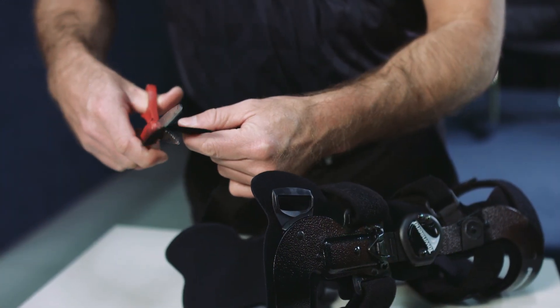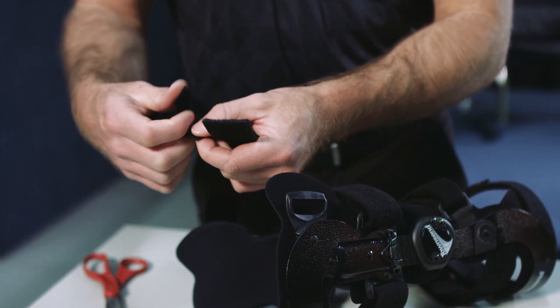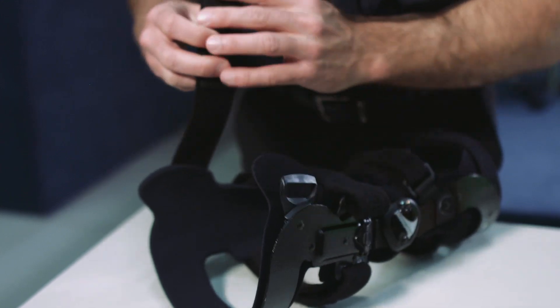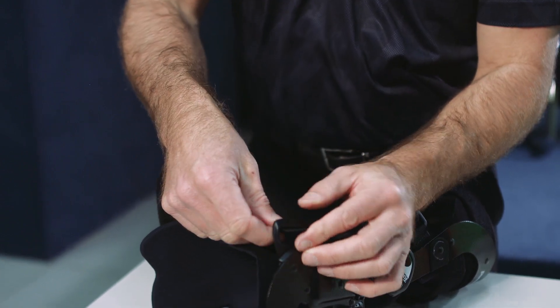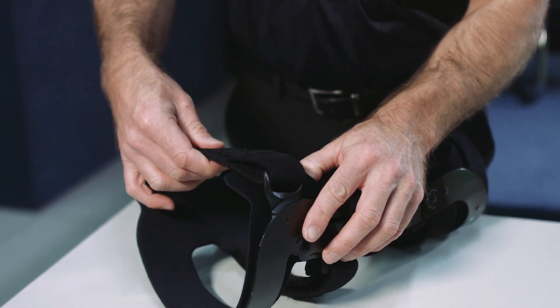If any strap is too long, remove the Velcro tab, trim the strap, and reapply the tab. If you notice the padding is passing through the buckle, reposition the pad away from the buckle so that it does not interfere with the fit. If the padding still interferes with the tightening of the strap, the pad can be trimmed with scissors and reapplied to the strap.